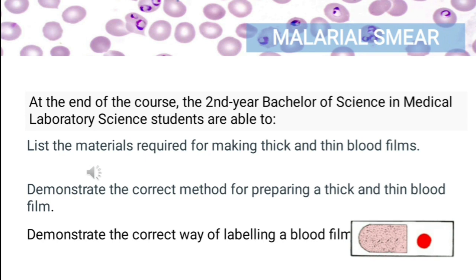The timing of blood collection for the study of malaria is crucial to success in retrieving the malarial parasites. The various morphologic forms of parasites visible at any given time depend on the stage of organism development at the time of specimen collection. For example, when the infected RBCs rupture, merozoites are present in the circulating blood. This stage, when found, is difficult to use as a species identifier. However, gametocytes may be present at this point in time and they are readily discernible.